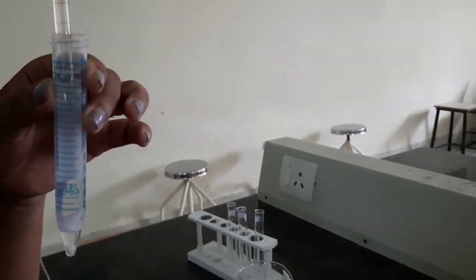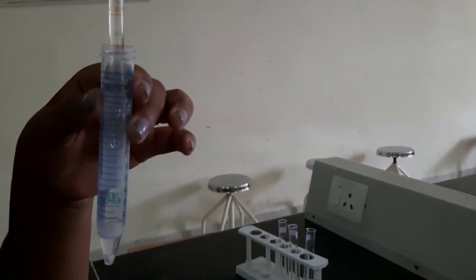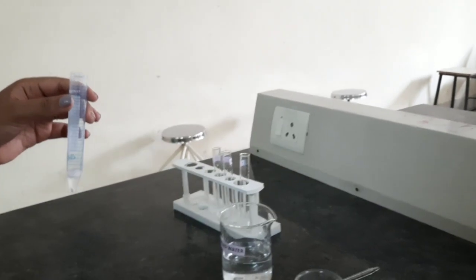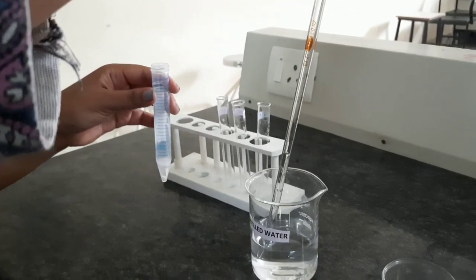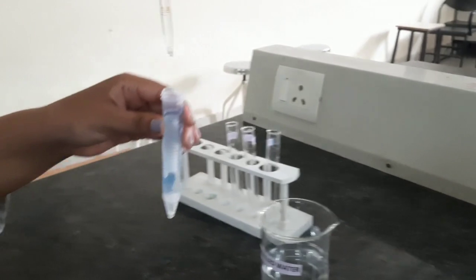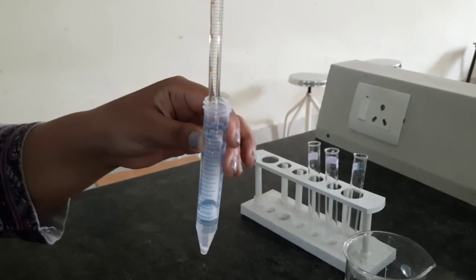Also, we are going to add 2.5 ml of distilled water. We will dissolve the pellet using 0.1 normal NaOH and distilled water. So we will take the distilled water, 2.5 ml. Using this, we are going to dissolve the pellet that has been obtained after centrifugation.